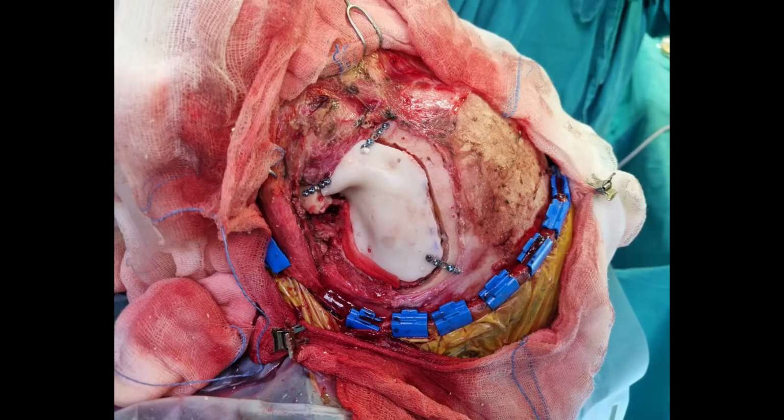And the last picture is showing the graft implanted and fixed into the place of the previously made skull defect. The fitting in the frontal bone is excellent, I could say, but on the control CT scan of the head after the surgery, there was a slight mismatch between the graft and the native bone on the base of the skull due to the unfavorable osteotomy of the skull base.